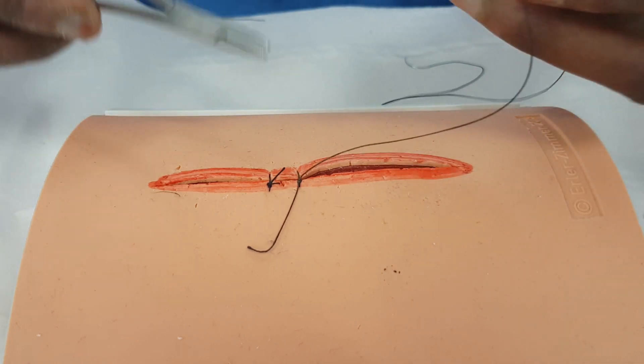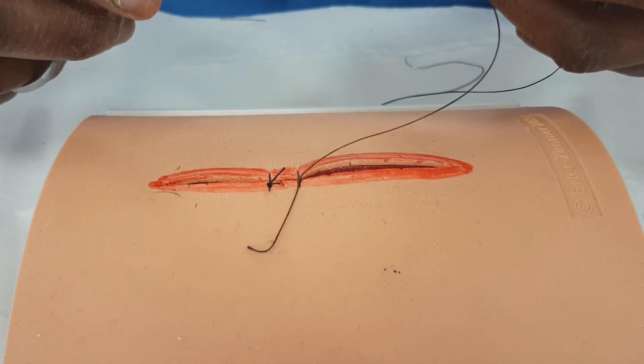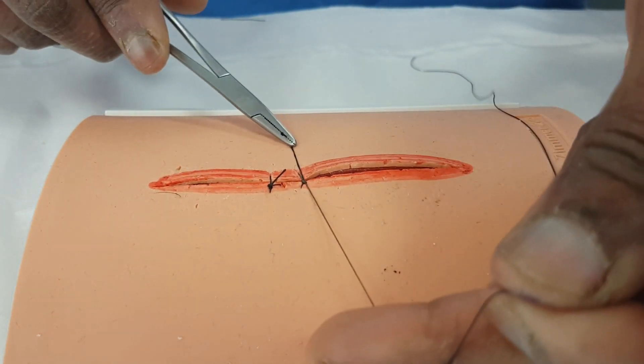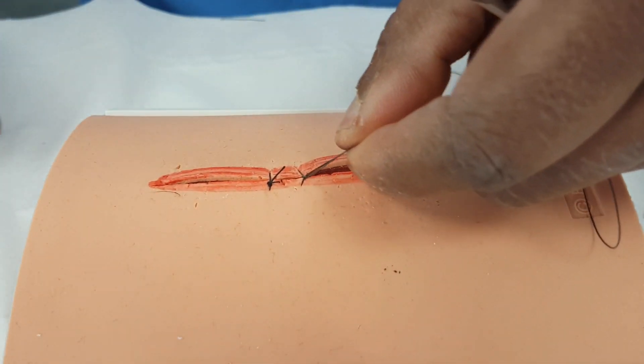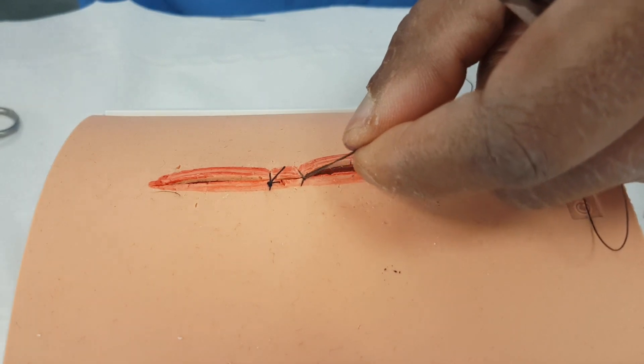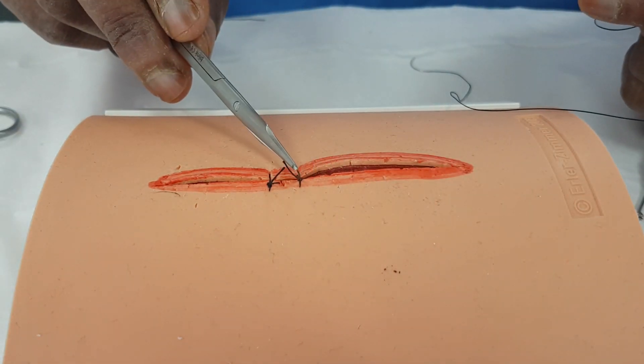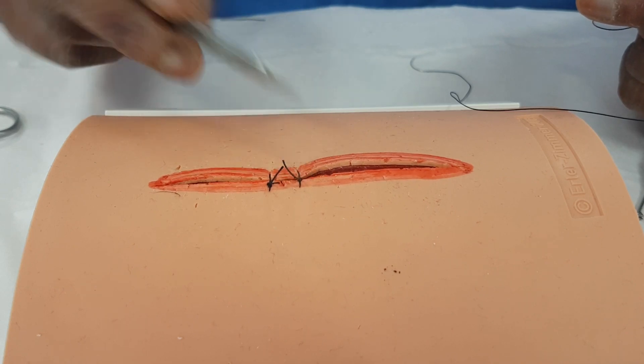If that wound is gaping, I'll use a bit more tension and put two throws. This is nice and easy because it's rubber — it's a simulation — and now we've got two stitches in there. You can carry on in the same way: make your decision, cut your stitch, and you can see that the ends of those tails don't interfere with the next stitch.